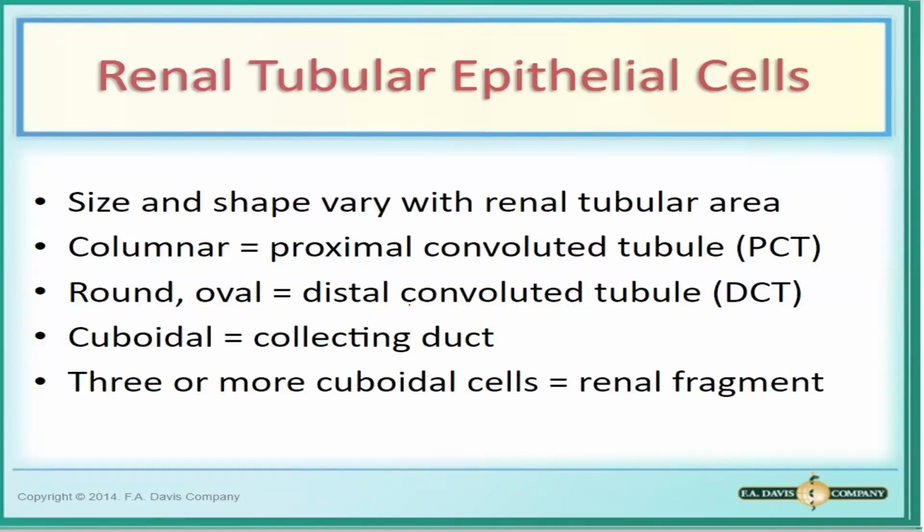The next, renal tubular cell. This is the most clinically significant in urine. So it indicates renal tubular necrosis. Saan ba ulit siya nanggaling? From your tubules. So if po siya ay nag-shed, it means there is damage within your tubules.